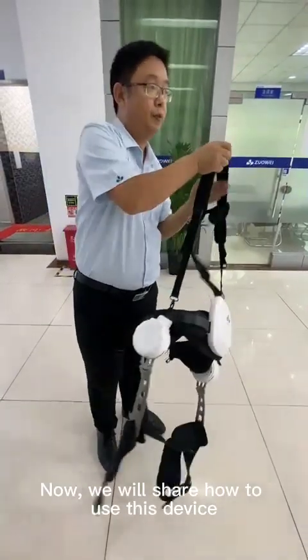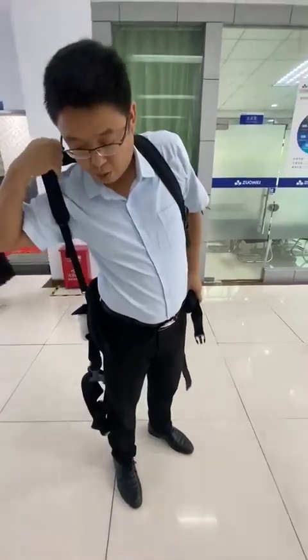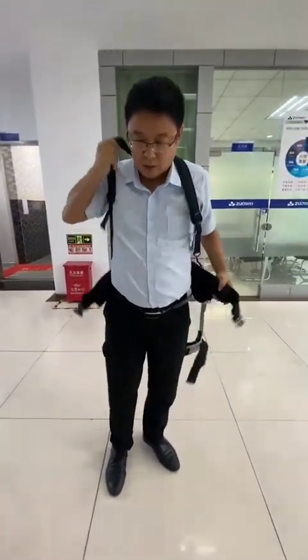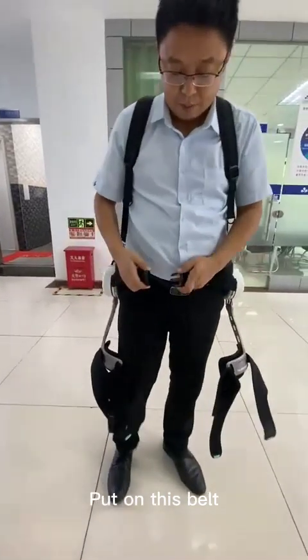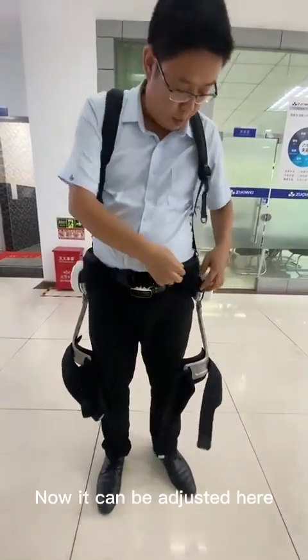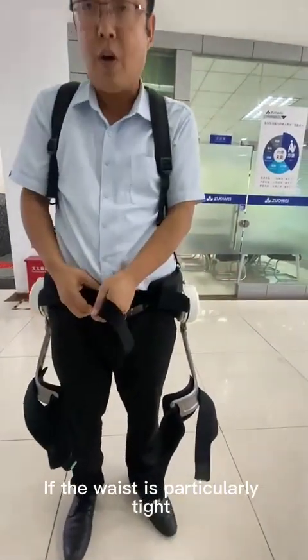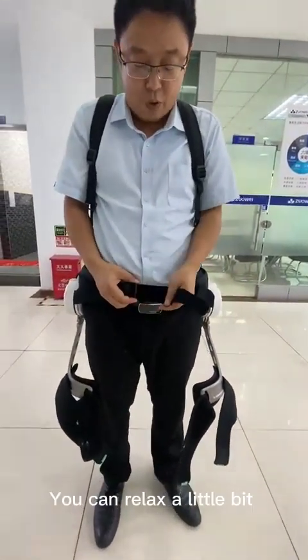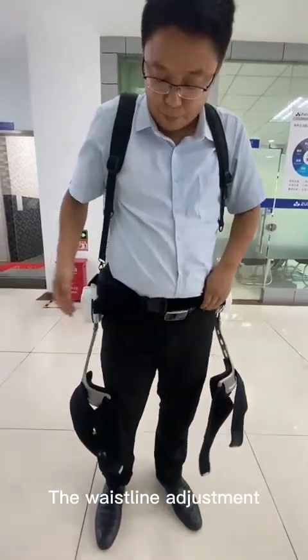Now, we will share how to use this device. Put on this belt. It can be adjusted here. This side can also be adjusted if the waist is particularly tight. You can relax a little bit, depending on the person's waistline adjustment.